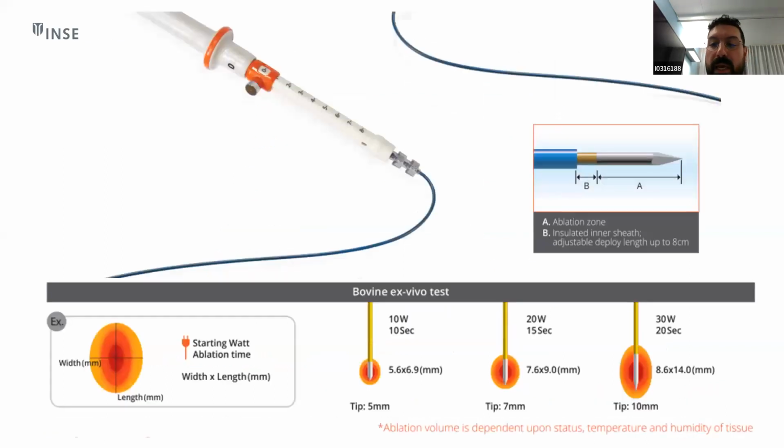Currently, the only FDA-approved device for EUS RFA is the one made by Taewoong Medical USA. It is a single-use 19-gauge RFA needle with an active tip length ranging from 5 to 15 millimeters, and the EUS RFA probe can deliver a current that generates high temperature electromagnetically, which can induce cell apoptosis and coagulative necrosis.